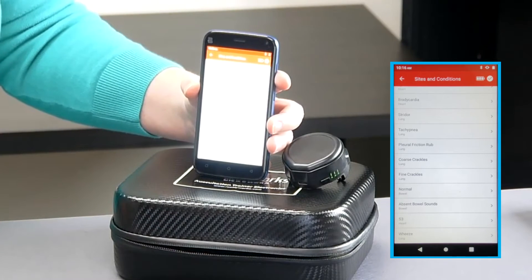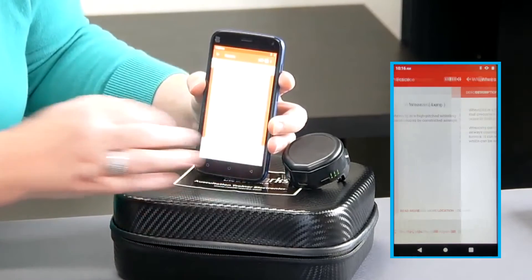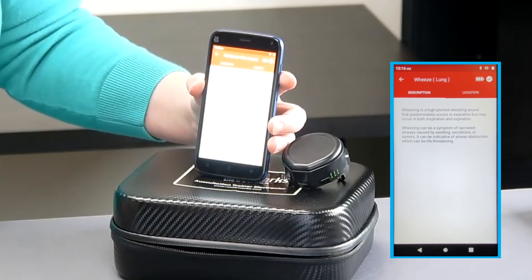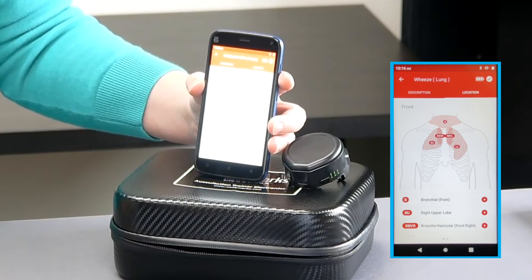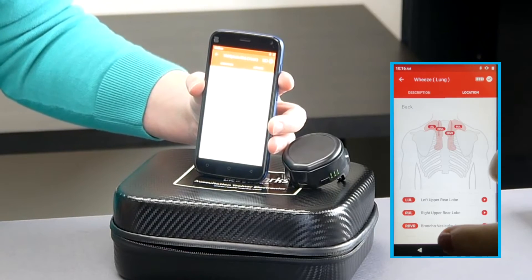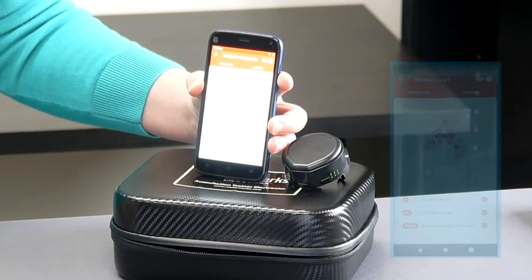The student can tap these cards, read a description of the condition, and tap 'Location' — this points out the correct stethoscope placement to hear that sound. Practicing this way really focuses students on connections between identifying the sounds they're hearing and the locations on the body.